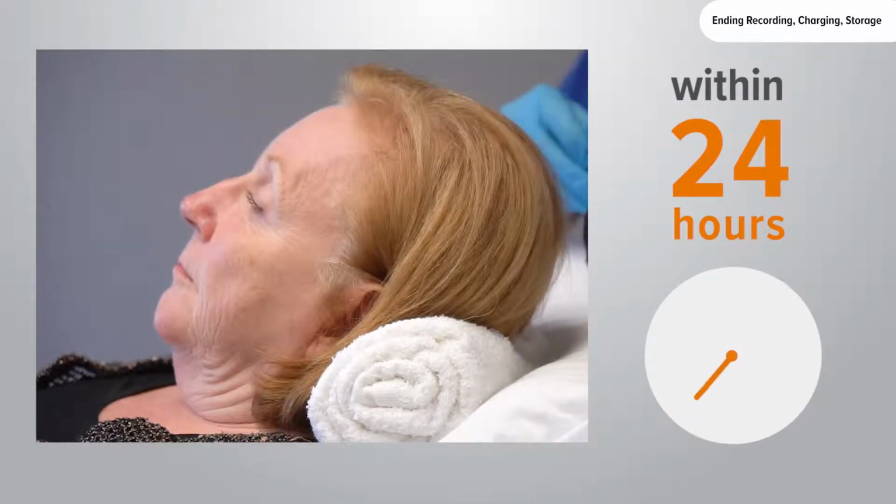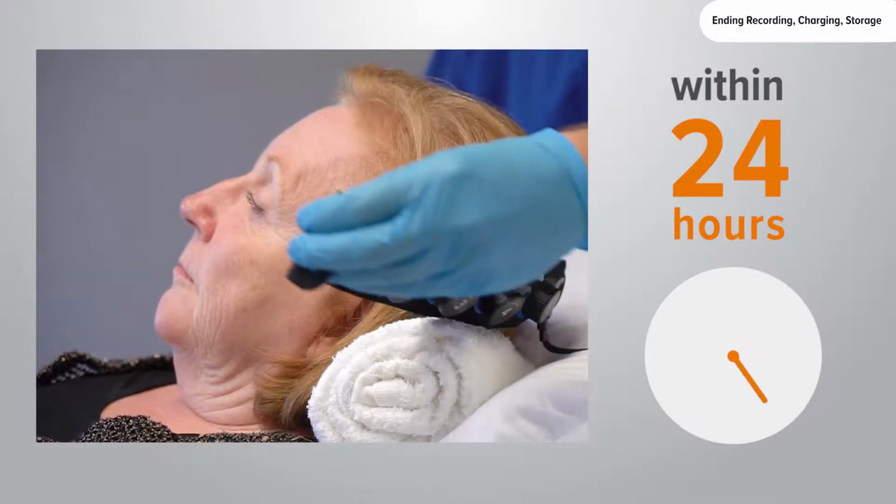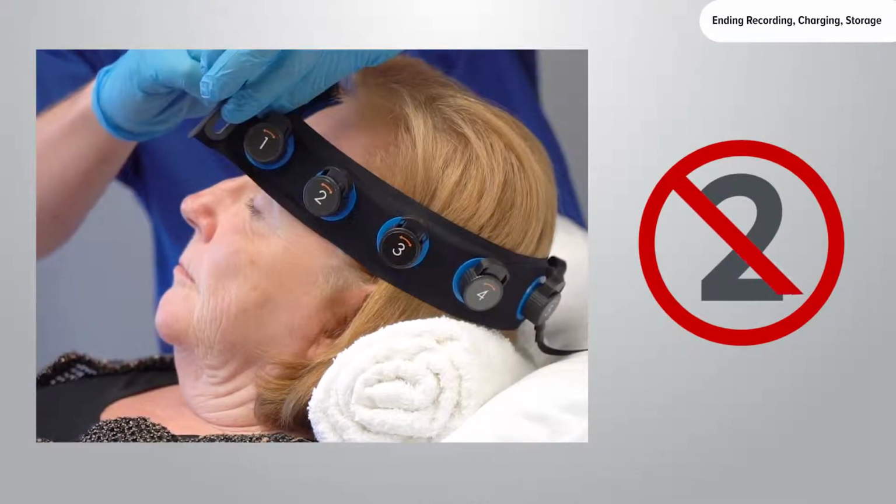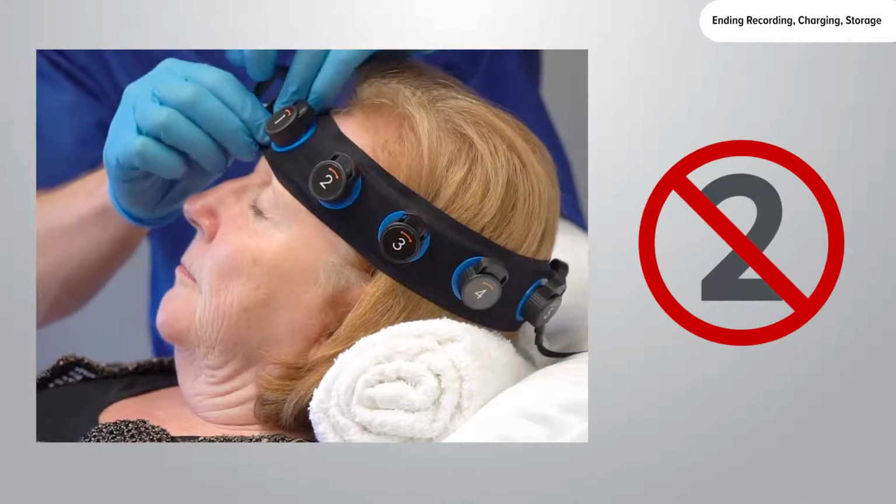The headband can be reapplied to the same patient if a second recording is needed within 24 hours. The headband is for single patient use and should be discarded after its use.